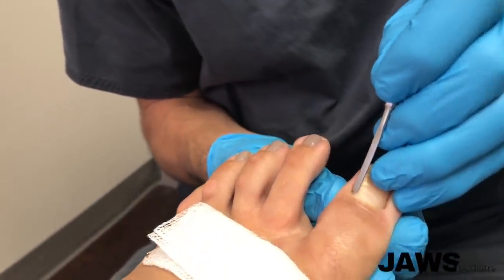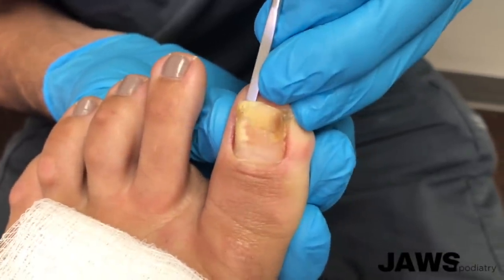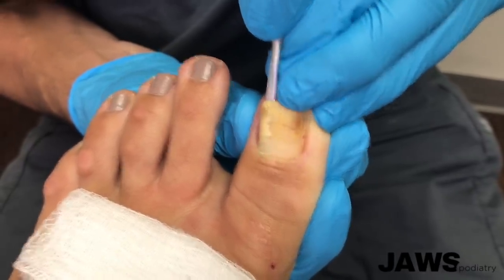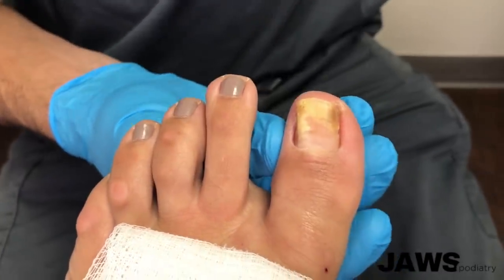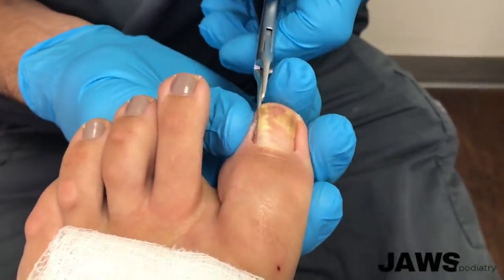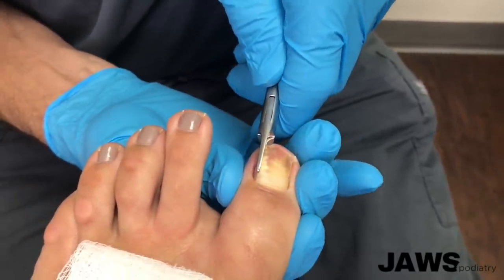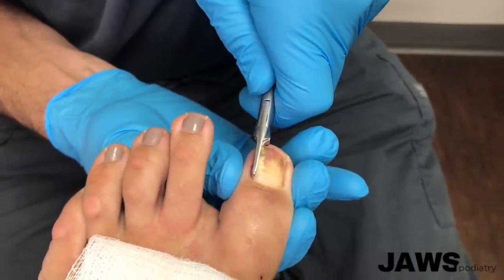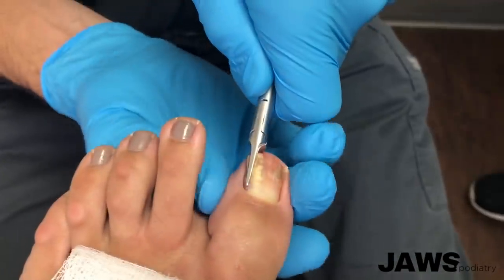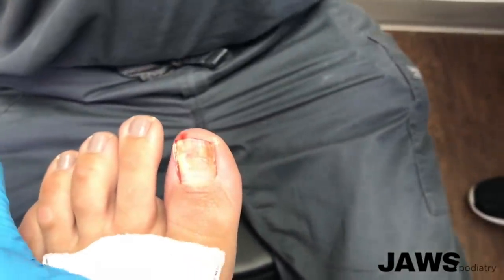This is going to create a significant amount of discomfort, and this is going to be a relatively big nail. It's fine distally, but here is where it's digging in again. So what we're doing here is using our English anvil — this is really going to alleviate the pain.